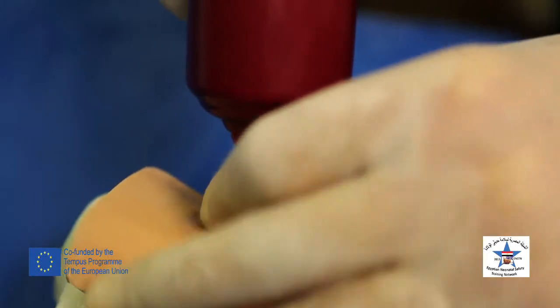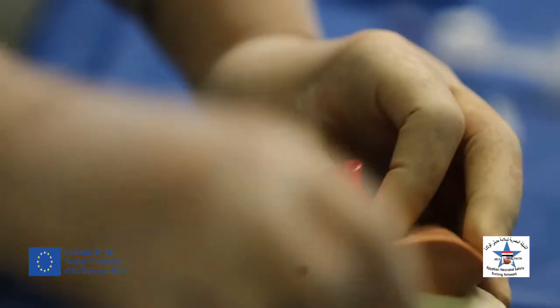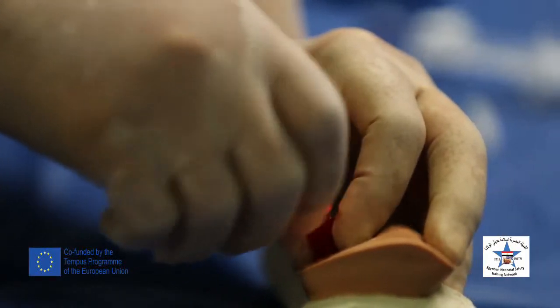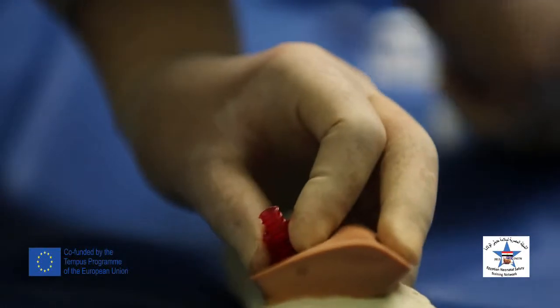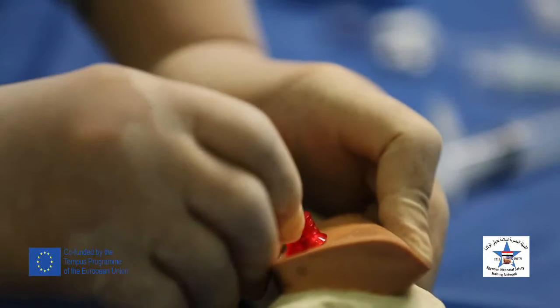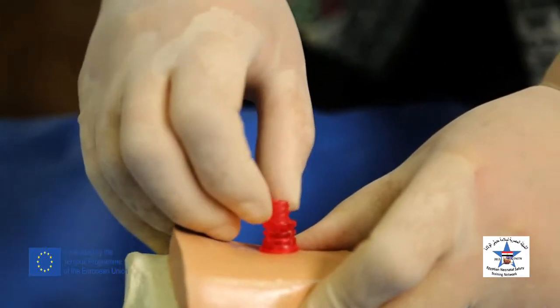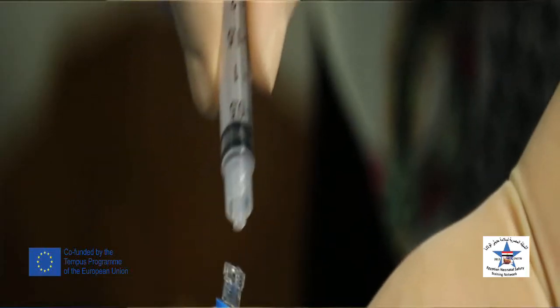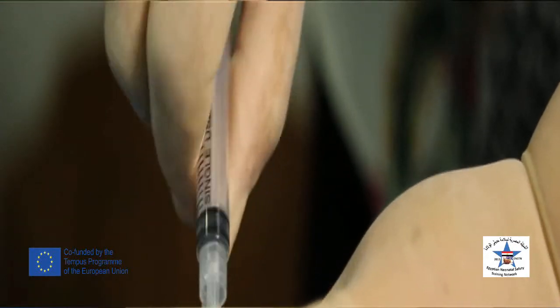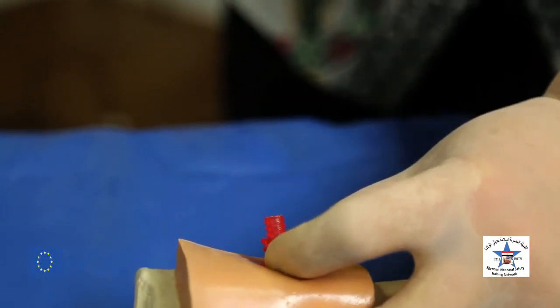Rotate the drill handle in an anti-clockwise manner. Remove the stylet of the needle, and we know that the needle is standing in place. We know that there is insertion of the needle into the marrow cavity. By that, the needle is standing in place. Blood is withdrawn from the needle. The sample is sent to the lab.